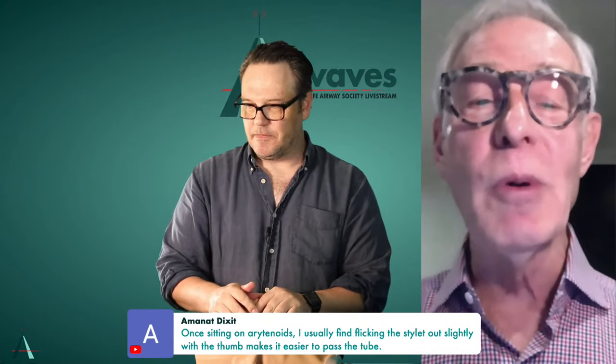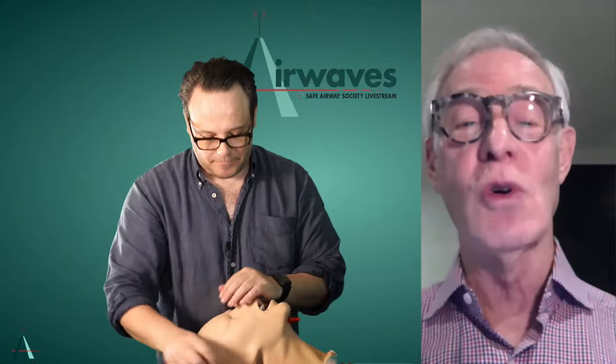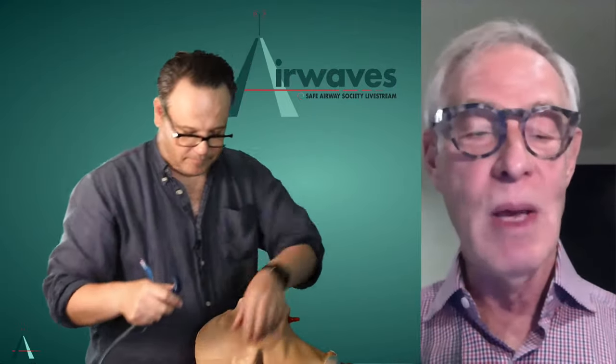Well, I deliberately try not to touch the arytenoids, not to touch the vocal cords, but to insert the tube... maybe I'm just finessing the point, but I try to make as little contact with the vocal cords as I can, or the arytenoids. Okay.